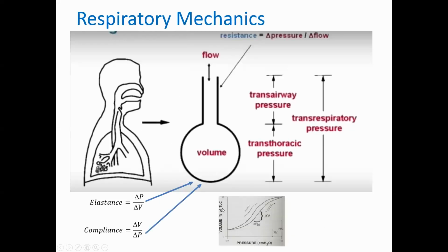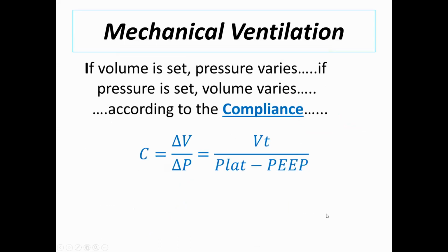This is just a reminder of what we said earlier about elastance and resistance. Every time you're adjusting the ventilator, particularly when it comes to PEEP, keep in mind that you will be able to impact this difference, which is referred to as the driving pressure. The smaller the driving pressure is, the better the compliance you will achieve with the ventilator, meaning you were able to recruit parts of the lung into the equation.